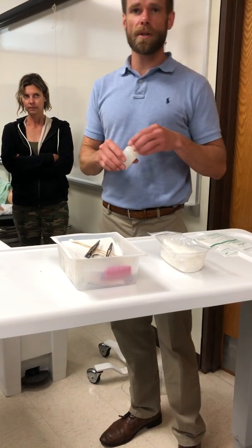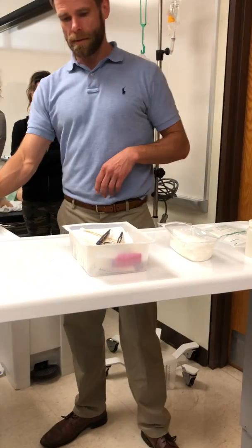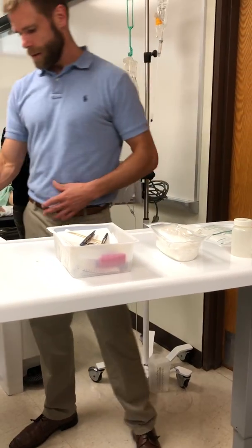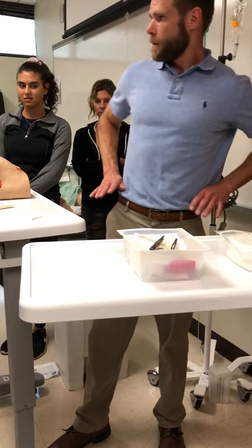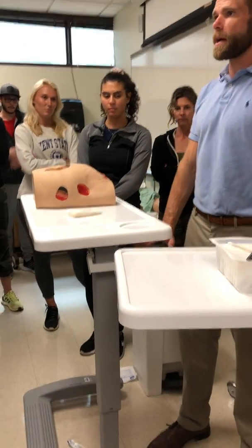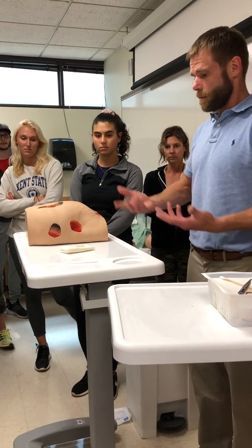Again, I don't need to do that, but I'm going to show you guys how to do that if you don't have the stuff that I have inside my kit. Circles always have to be above my hip, my waist. My hands go down here, and I'm looking at Billy. I can't see my hands. I can see my hands. So, above my waist.